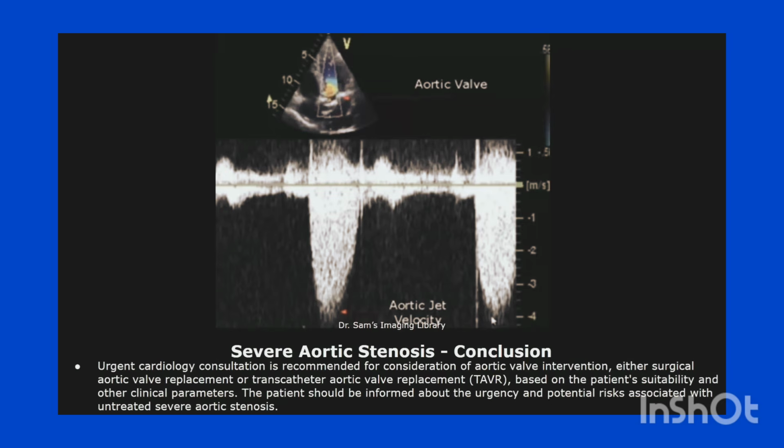Urgent cardiology consultation is recommended for consideration of aortic valve intervention, either surgical aortic valve replacement or transcatheter aortic valve replacement based on the patient's suitability and other clinical parameters. The patient should be informed about the urgency and potential risks associated with untreated severe aortic stenosis.